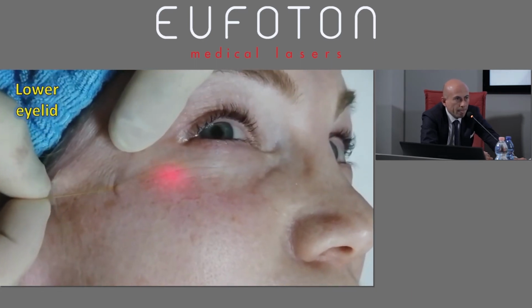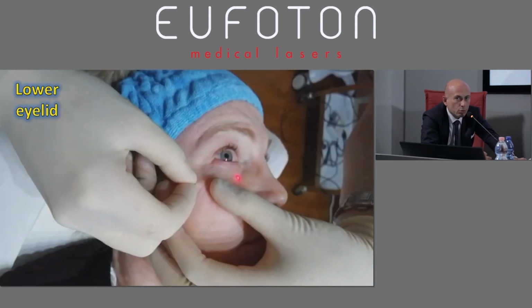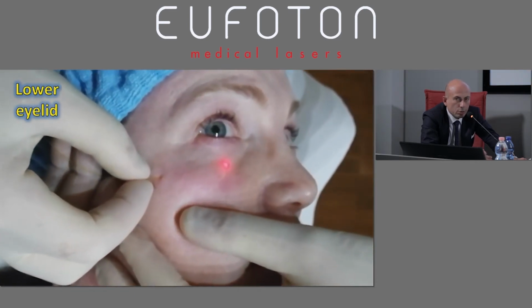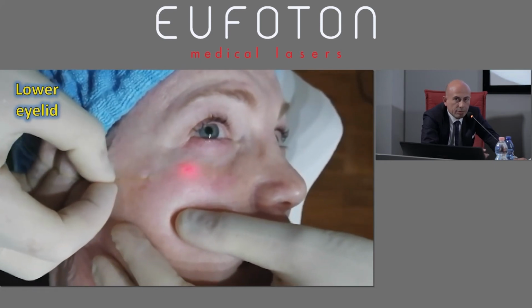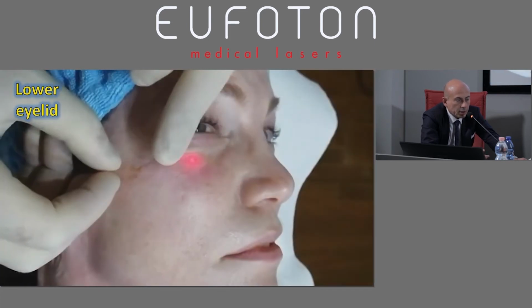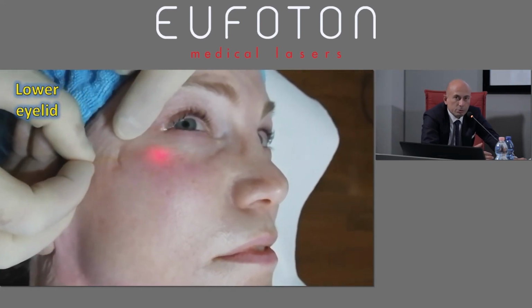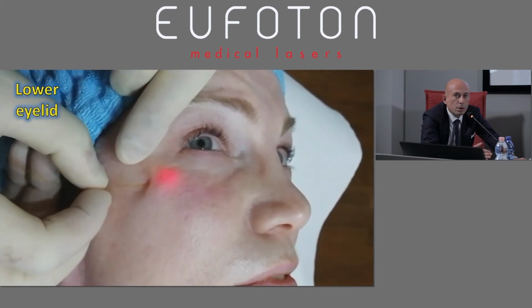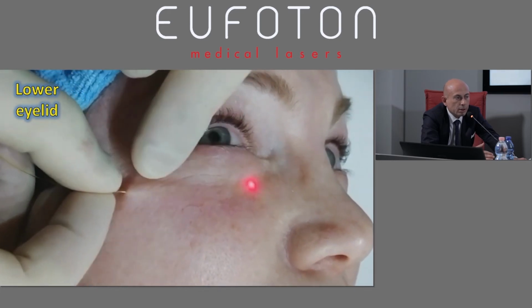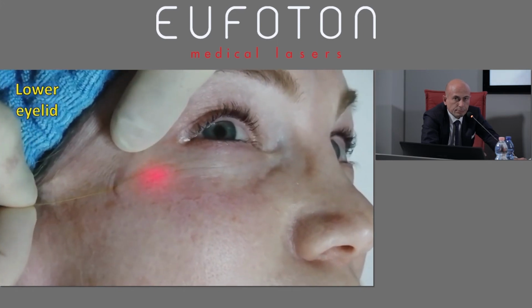So we repeat, multi-use fibers are reused just for lipolysis, monitoring the possible degree of carbonization and getting rid of the burnt cap using a sterile surgical knife inside the cannula. Also in liposculpture, we see some migration towards disposable materials with a lapped tip, giving carbonization that cannot be compared, much lower than the other group.